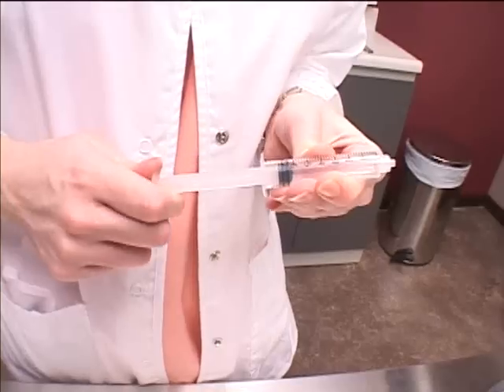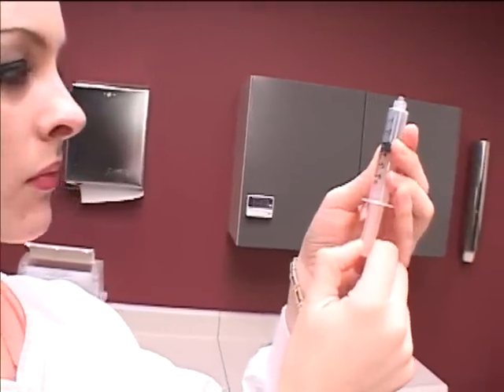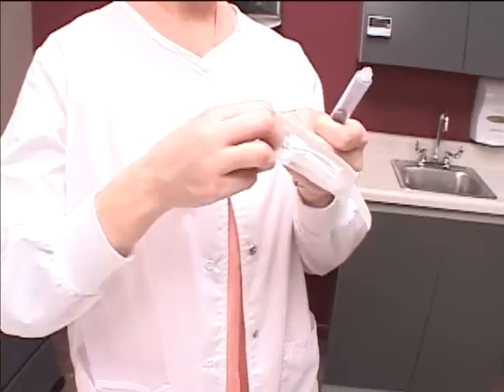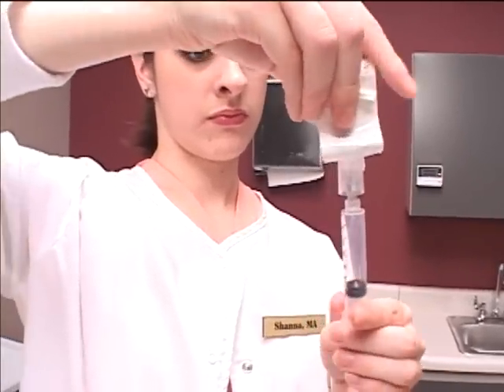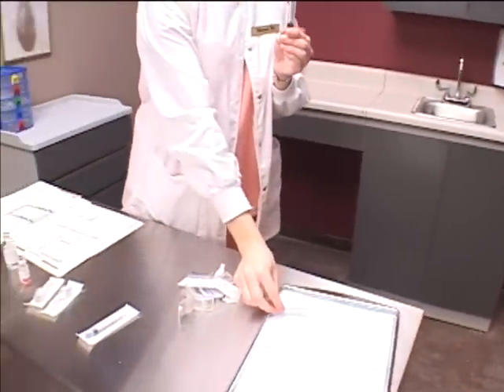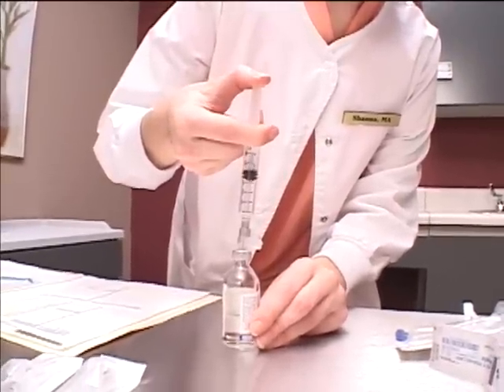Open the syringe and loosen the barrel by gently moving the plunger back and forth. Holding the syringe at eye level, withdraw an amount of air equal to the amount of diluent to be withdrawn. Open the needle and attach it to the syringe. Uncap the needle and place it on a clean surface. Insert the needle into the vial and slowly inject the air.